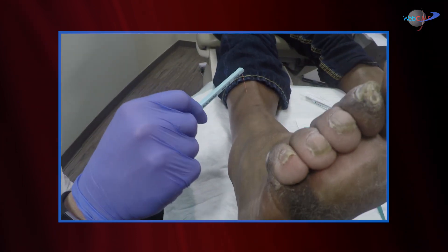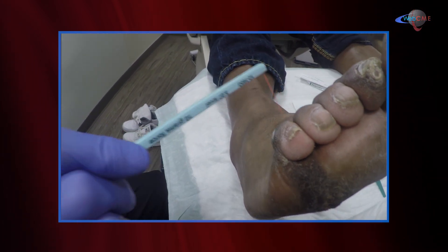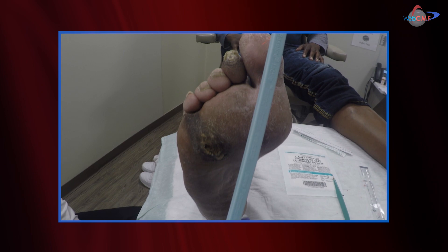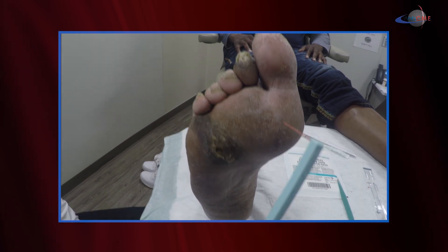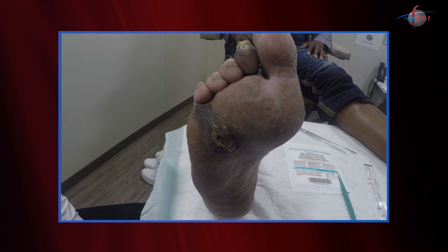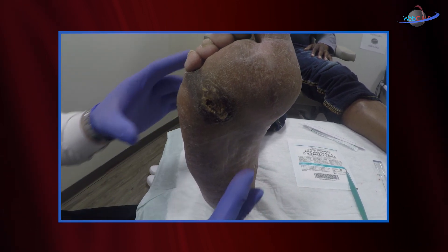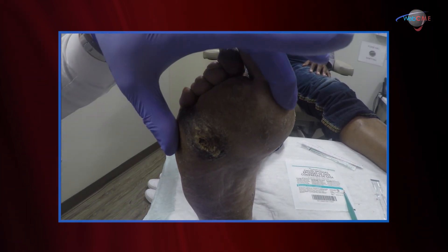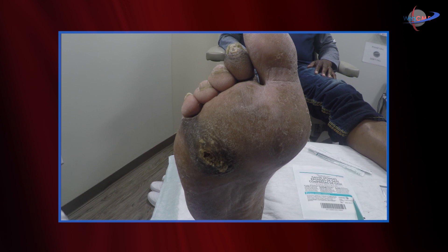We can distinguish the patient's sensation by checking up on the leg first. Can you feel this? He's able to feel that there. How about here? Yes. So the dorsal surface is intact from a sensation standpoint. Coming down to the toes — tell me if you feel me touching you. Yes, top of my toe. How about here? No. He has some sensation here. So we can see he does have some sensation over the dorsal and proximal part of the foot, but the distal part of the foot has some early neuropathy changes with decreased sensation.